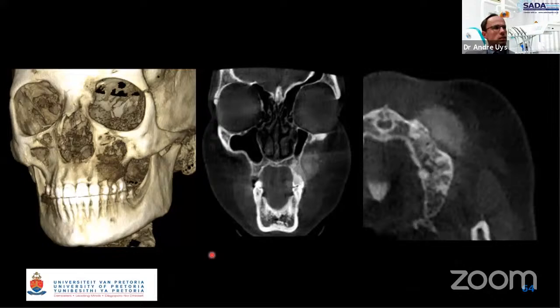And as you can see here, this CT was quite a large field of view CT. It's probably not indicated for a lesion like this. We could have taken a smaller CT, but what we can see here is an ill-defined radiopaque lesion in the soft tissue here. You can see it's extending into that soft tissue. There's also a loss of the cortex and a change of the bone in that area. So this is typically that sunray appearance that you'll see. And this was then diagnosed as an osteosarcoma for this patient.